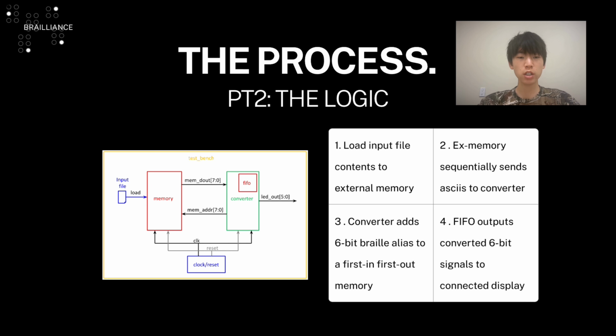This logic diagram is of our ASIC. The converter module sends a signal requesting a next available ASCII, which is sent to the converter to be translated into a 6-bit alias, finally getting stored into a first-in, first-out memory block to be outputted in the order of the input. The clock serves to create the timing of the process, while the reset restarts the process.